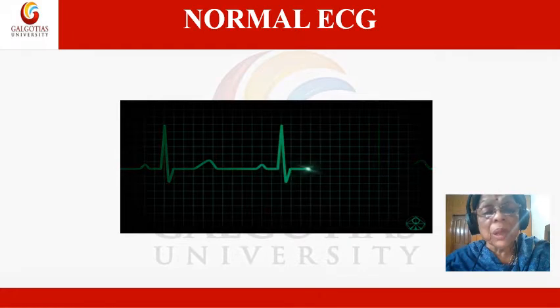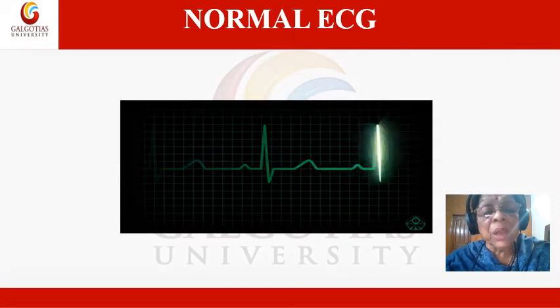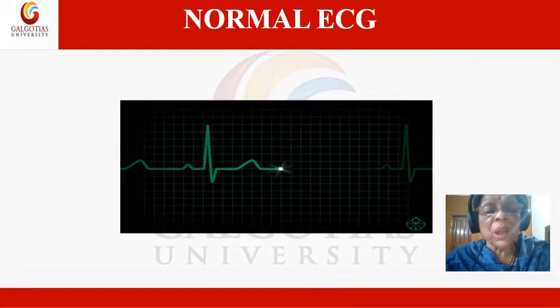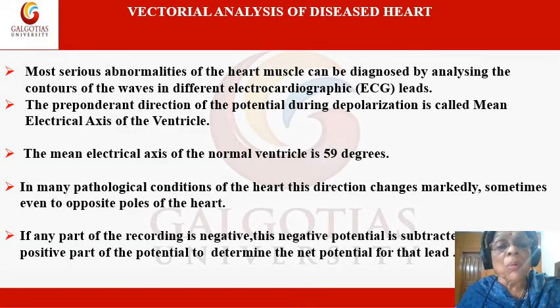So this is the normal ECG, and when the heart is diseased or when there is some problem with the cardiac tissue or with the conduction of the impulse in the heart, there is change in the ECG recording, and that can be traced with the help of the vectorial analysis. Now, vectorial analysis of the diseased heart.